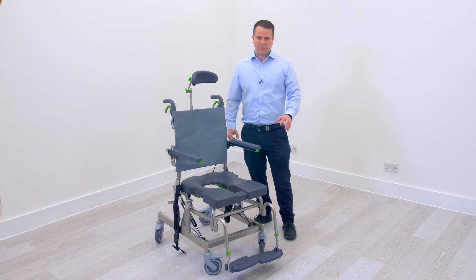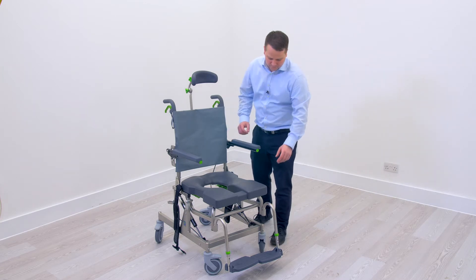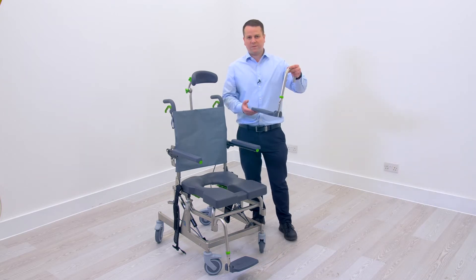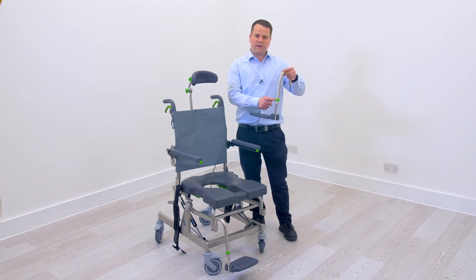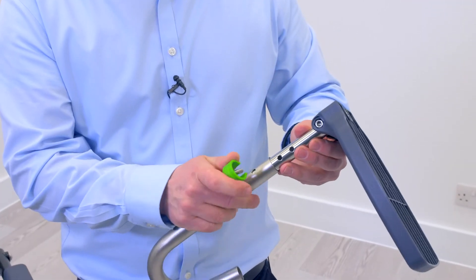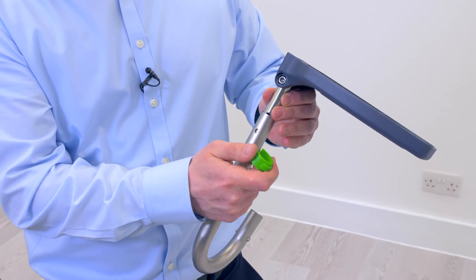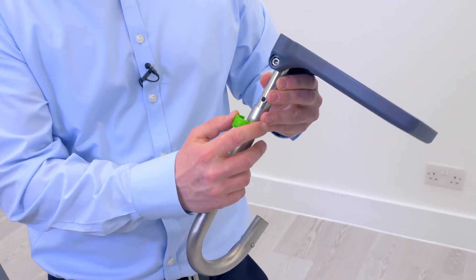Firstly, we want to adjust the foot plate height. This is done by removing the foot plate, removing the pin, and the foot plate will adjust by 10 centimetres to provide the correct foot plate height.